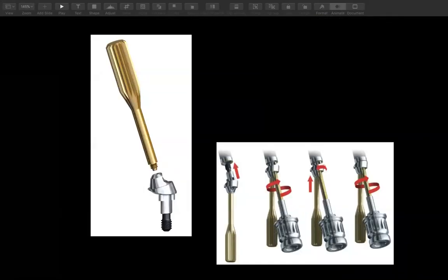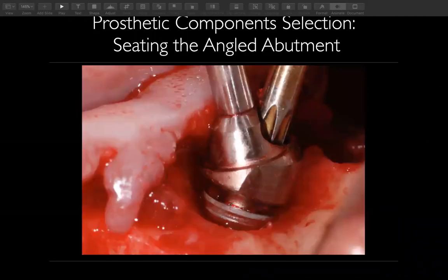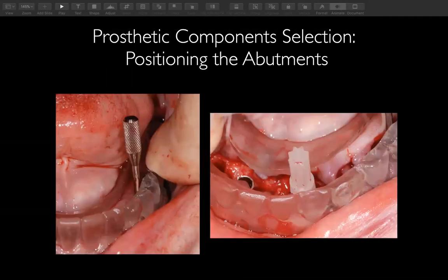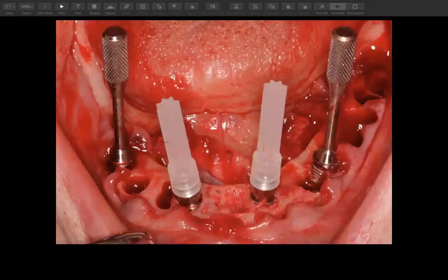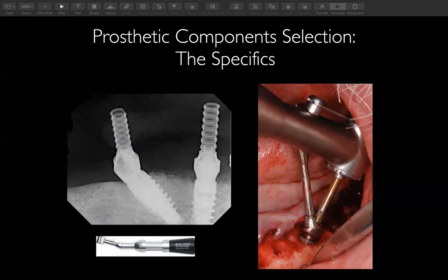So the multi-unit abutment, angled abutment here, you can see it has a metal handle that screws in right to where the restorative screw was screwed to the top. There's two screws, the restorative screw and this screw to tighten a multi-unit abutment, that's only a 15 Newton centimeters torque. Even though it's still a bigger screw, you would think you could do maybe 30, 35. It's not. It is 15. You can see they're seated. We want to make sure that those handles are coming through occlusally. That's why we have that trough. It works so well. So here you can see in the pictures, they're seated. I like to have that doctor do an x-ray, making sure everything's down and seated completely.